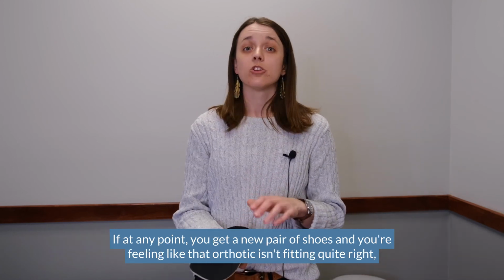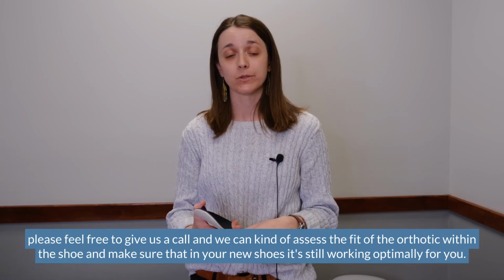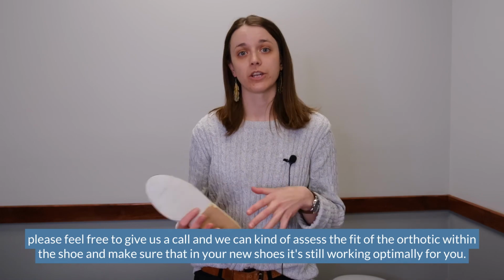If at any point you get a new pair of shoes and you're feeling like that orthotic isn't fitting quite right, please feel free to give us a call, and we can assess the fit of the orthotic within the shoe and make sure that in your new shoes it's still working optimally for you.